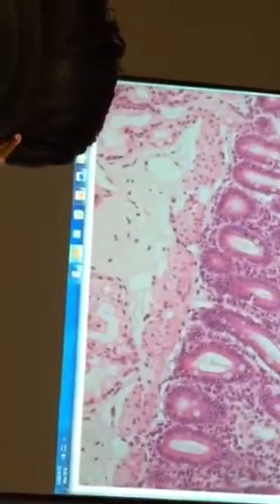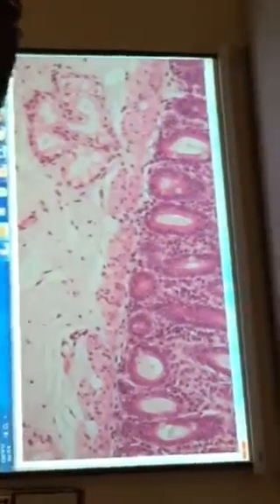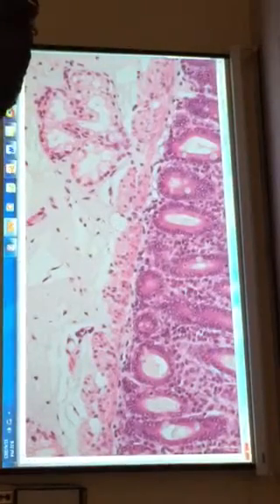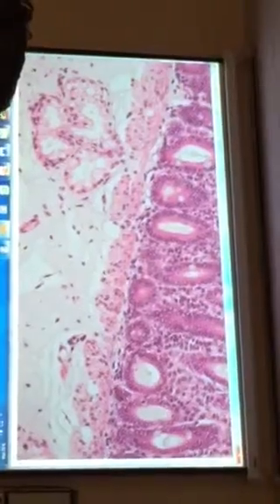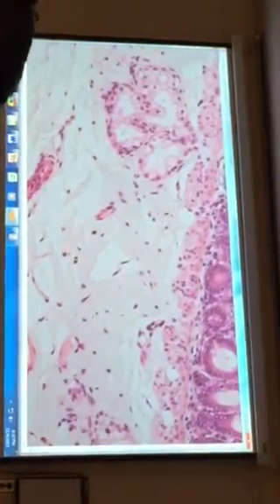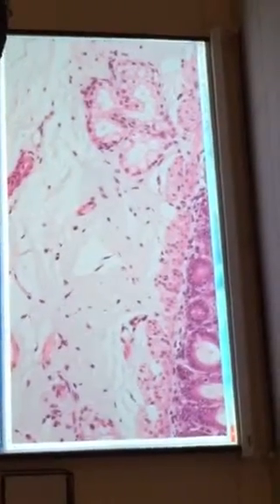All right, so there's the muscularis mucosae. It's the first time we've seen that. So we're still in the mucosa. It's the little smooth muscle layer that helps to move the folds, the plicae. All right, so now we're going to go down to the submucosa. So here's the submucosa. It started right about in here. They're tied together, of course.